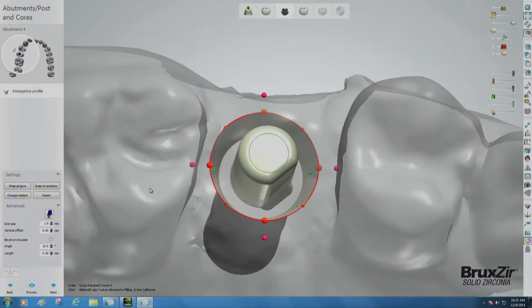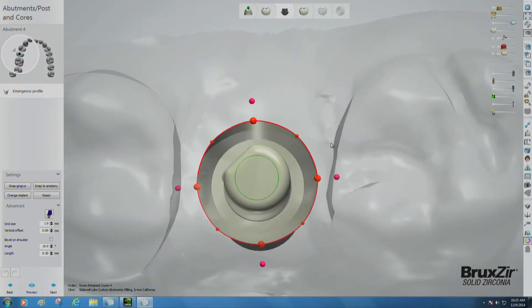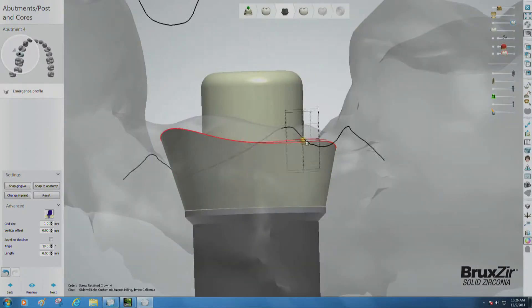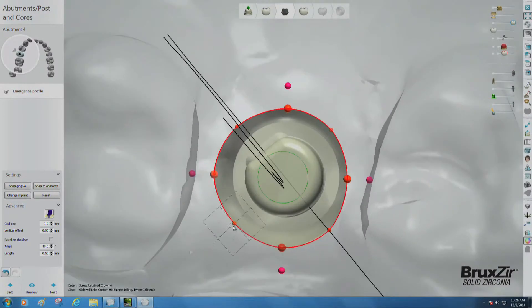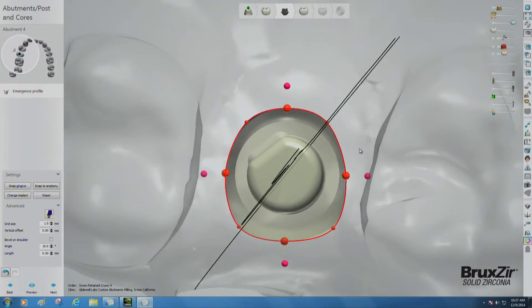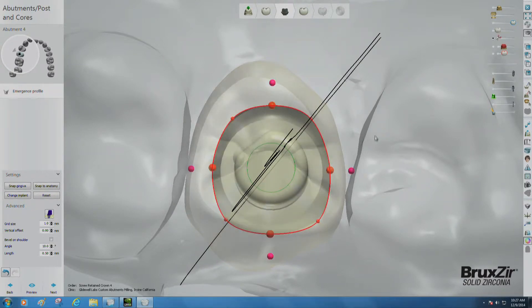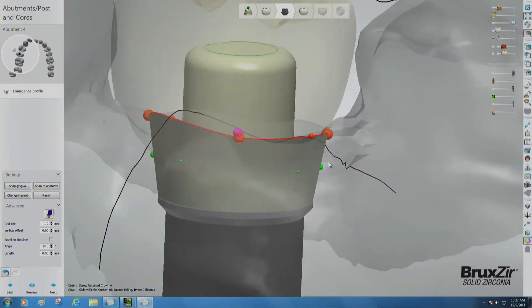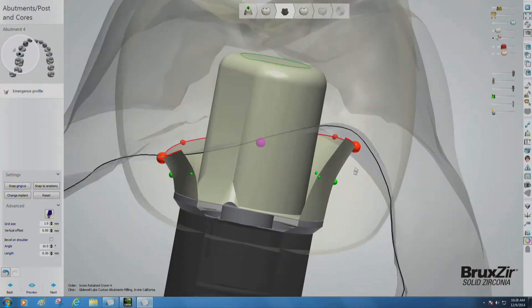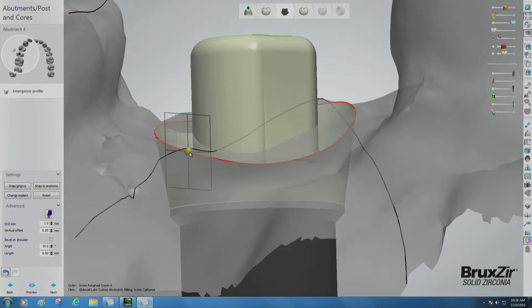Click Next. Now the software will tell you it's time to shape the emergence profile. Since our case is a premolar, we're creating a shape that is a bit more triangular. Rotate the crown on the screen so that the working occlusal is directly in front of you, and make sure the overall shape is naturally matching the emergent shape you've created. Then rotate the view to the sides and pull the colored dot handles, moving the margins to match the tissue level. You'll see a cross-sectional view of the tissue and crown, with a black line highlighting the edge of the tissue and the red line depicting the line of the crown.